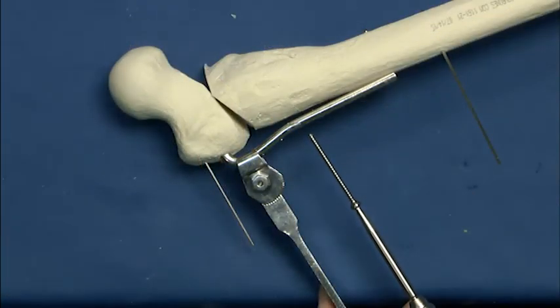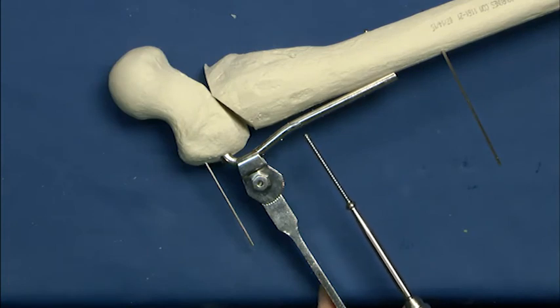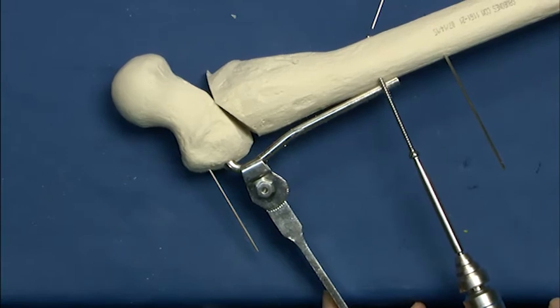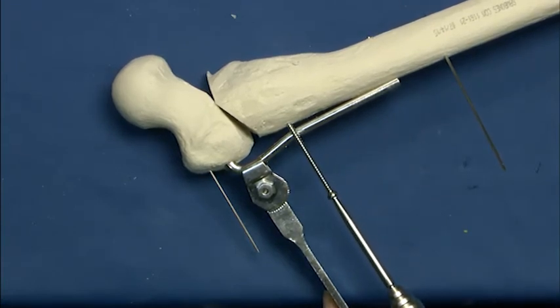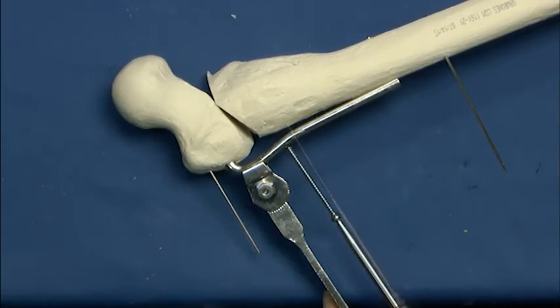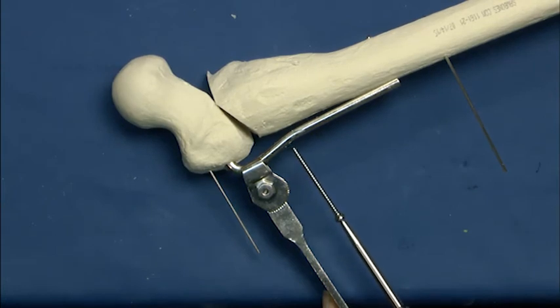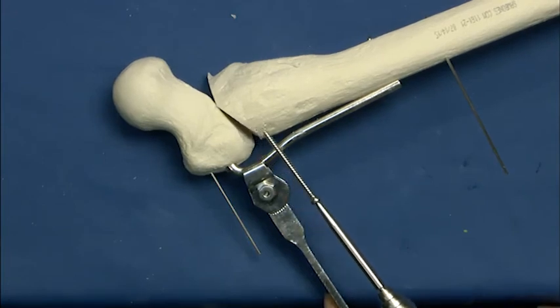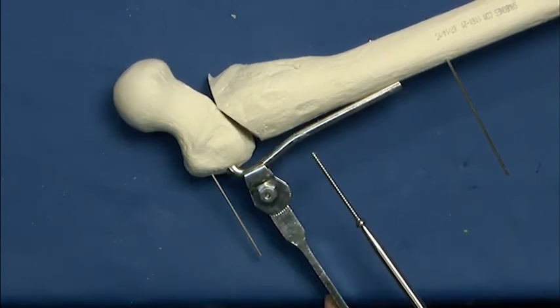At this point, we've now attached our blade to the proximal segment and to the distal segment with a single bicortical screw with this gap. Now that gap is the method by which we can essentially translate the shaft laterally and in the process compress along this oblique fracture plane.